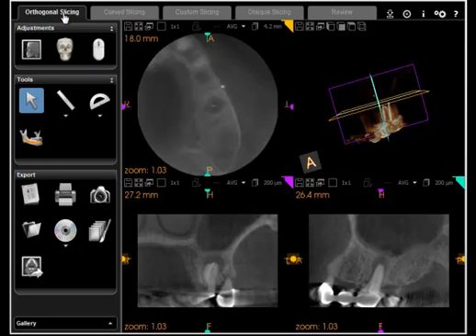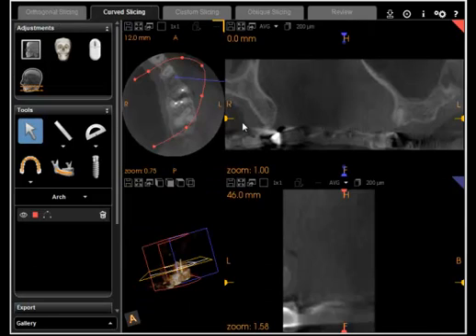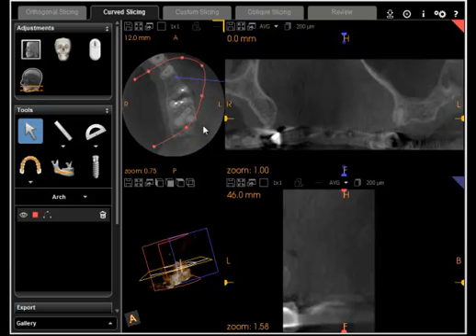Next we move from the orthogonal slicing tab to the curve slicing tab. Obviously portions of the dental anatomy and dental arch are not straight, as the orthogonal slices are just strictly straight planar slices.